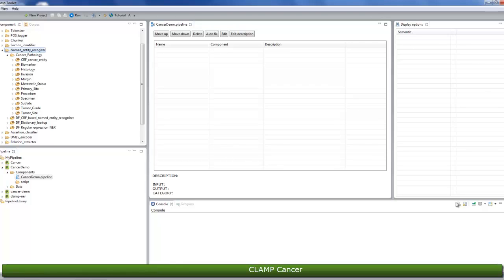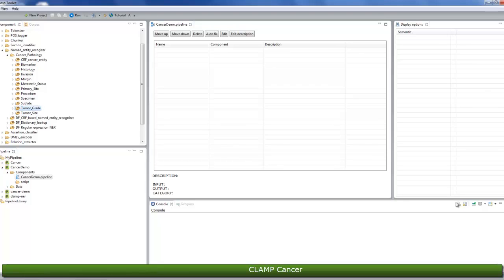Primary site is a component that represents the primary organ or tissue where the specimen comes from. The histology component helps identify the histological type or morphology of a cancer. It shows the origin and nature of a tumor. The biomarker component extracts information related to the immunohistochemical tests and their values.